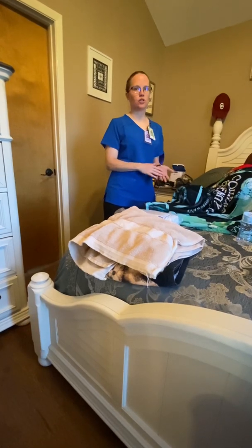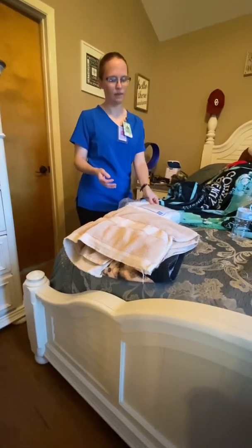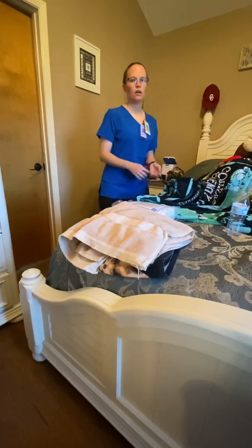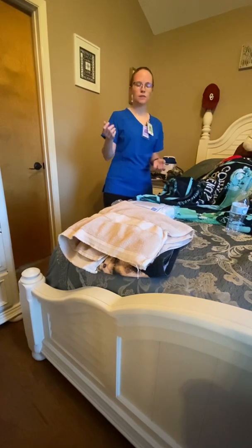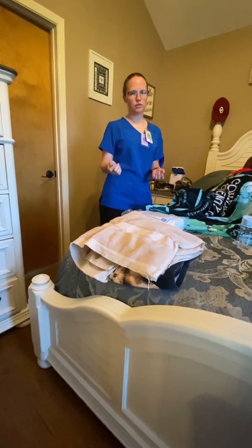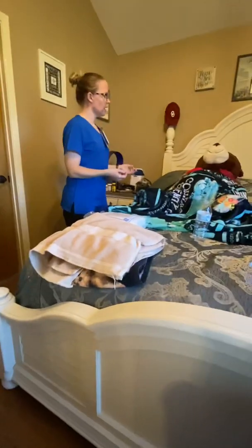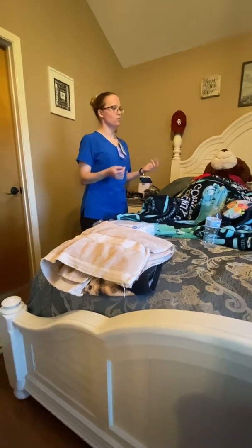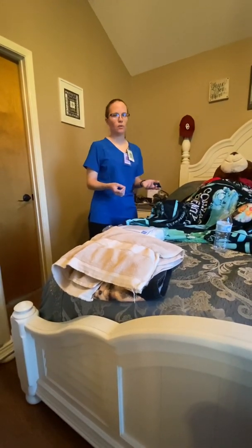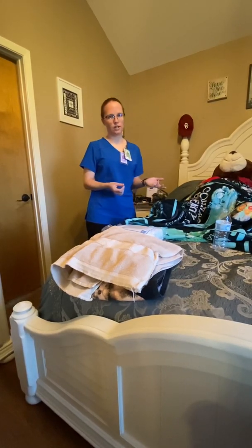Once we verify there's documentation, we'll gather all our supplies that we're going to need. We're going to need a cath kit, and we'll need a couple of bath blankets. We're going to also provide privacy for the patient by either closing the door or closing the curtain where the patient's bed is. We're going to introduce ourselves to our patient, and then we're going to ask for the patient's two identifying factors, their name and their birth date. Once we do that, we're going to explain the procedure to them and why we're performing it for them today.